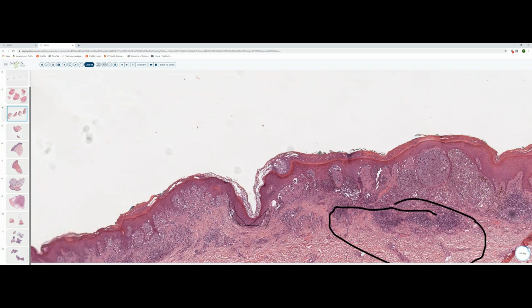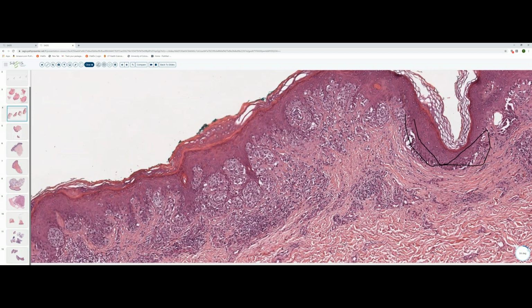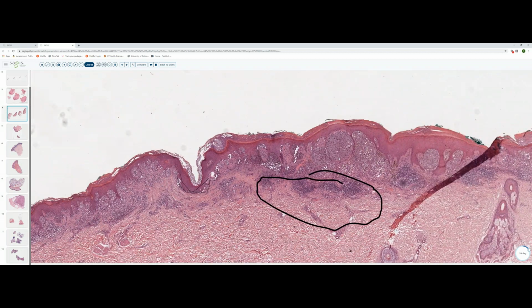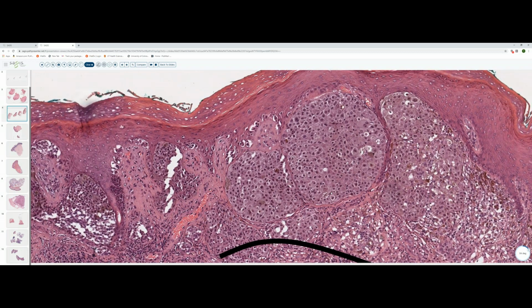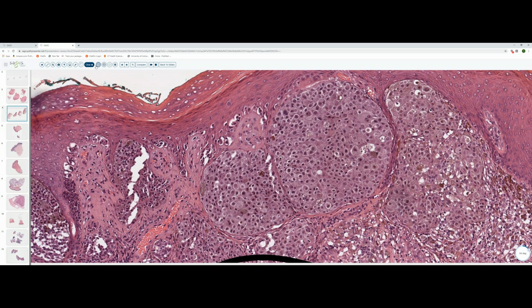There is, in some areas, upward scatter of melanocytes as solitary units and nests into the overlying epidermis. And then cytologically, if you look, these cells are really atypical. Marked nuclear pleomorphism. The nuclei are variable in size and shape. Some of them are quite hyperchromatic. And look at the cytoplasm of these melanocytes. It contains this kind of dusty gray-brown cytoplasm.